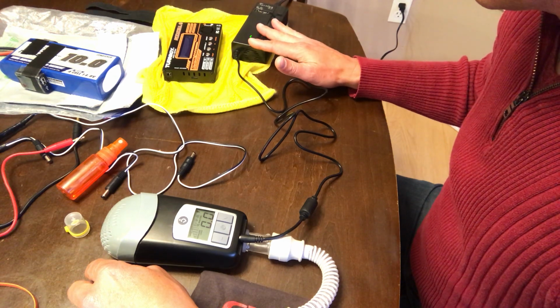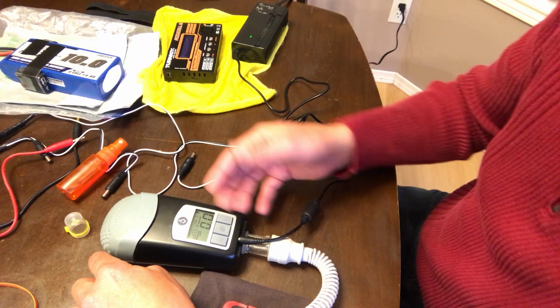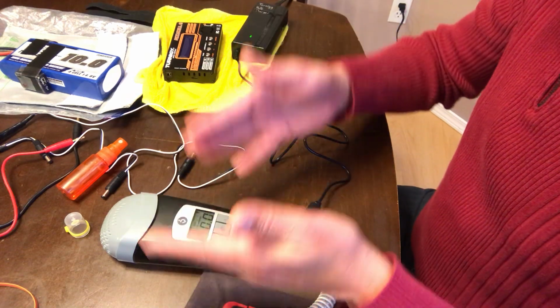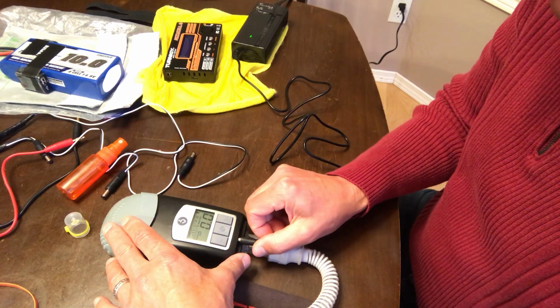Right? And that's fantastic. So say you're at a hostel or a hotel and you need to recharge your battery. Well, you also need to sleep. And so if you have limited time, I wanted to be able to use my CPAP machine while I'm sleeping as well as charge my battery. So I'm going to pull this out for a minute.